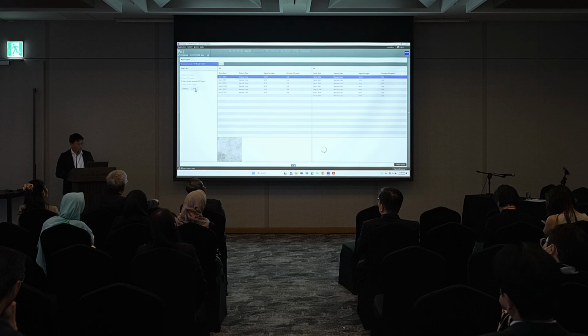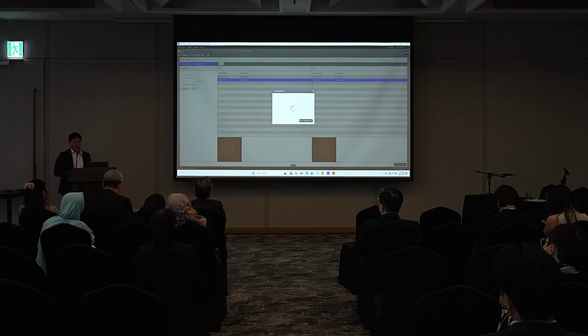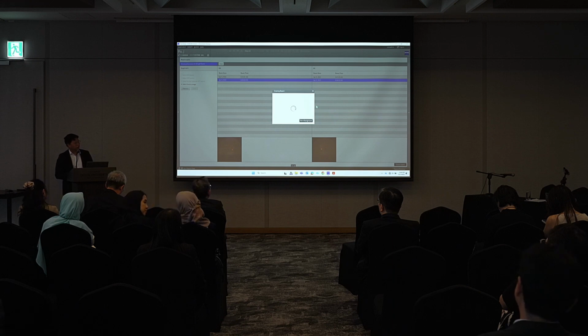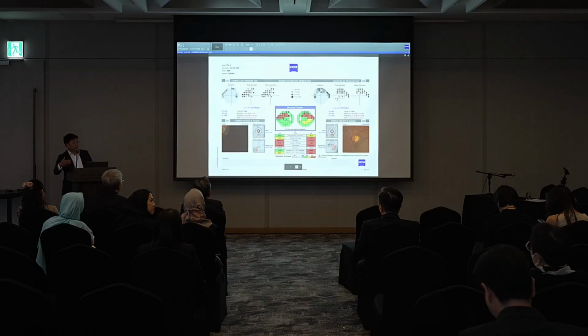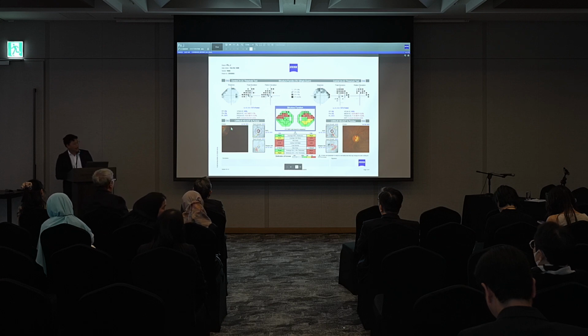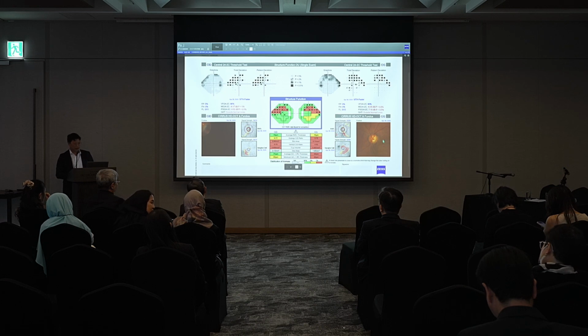So we're going to quickly run back and select our fundus image, and we're going to select that side now. And so we're going to create a report with both eyes. And as you can see, that's how quick it is to create these structure function reports. So now we're going to rerun it with our right eye and our left eye. But just to show you the advantages, and in truth, we've got to show the limitations of the system as well. So here's that image with a lot of artifact overlying the optic nerve, where segmentation couldn't be accurately done for the optic nerve. But more typically, you'll get a very nice image of the eye if there's no artifact available.